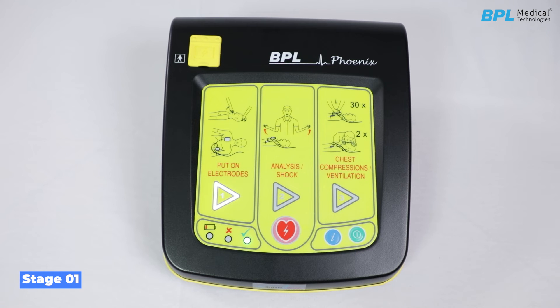The following voice prompts are heard: ask someone to call the emergency number. Open the patient's airway by lifting the chin and tilting the head backwards. If the patient is unconscious, unresponsive, and not breathing normally, remove clothing from the chest and stick on electrodes. Stick electrodes on the patient's bare chest as shown on the electrode packaging.